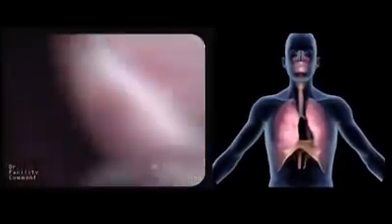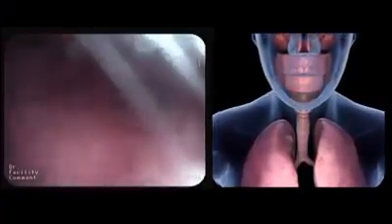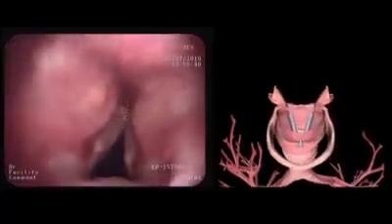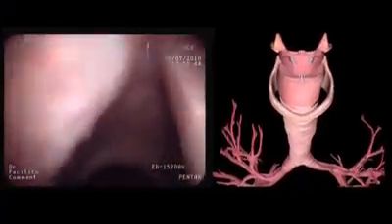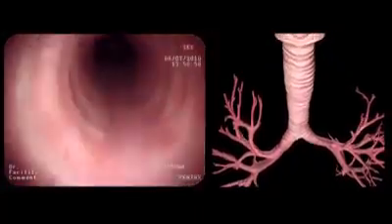In this film, we perform a tour of the normal segmental anatomy of the bronchi by means of bronchoscopy on a healthy volunteer under local anesthesia. After passage through the nose, the pharynx and the epiglottis, the glottis is reached. After inspection of the vocal cords and arytenoids, the bronchoscope is advanced into the trachea. While staying in the middle of the airway lumen, the trachea is carefully inspected.